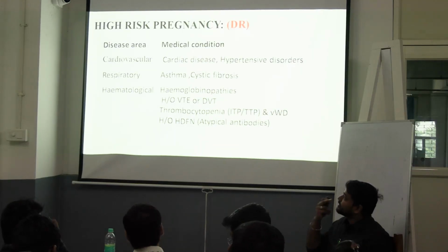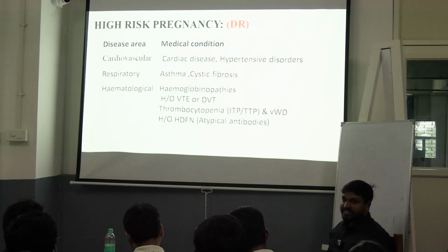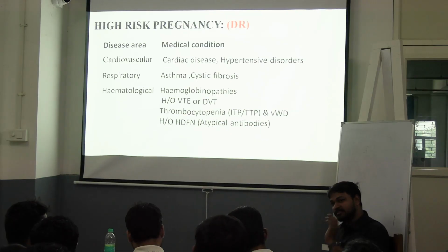So, define risk. When should we do a CTG? CTG is not necessary for every patient getting admitted. Many patients get admitted, but not every patient needs a CTG.